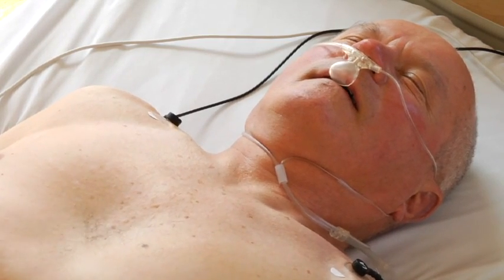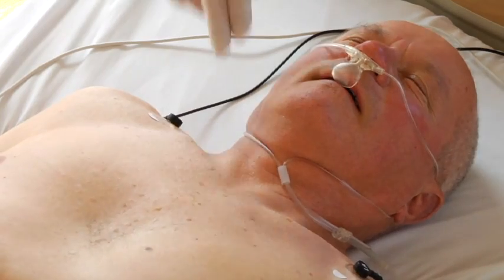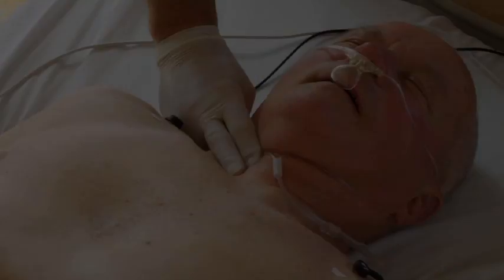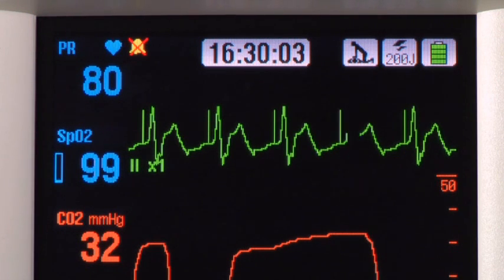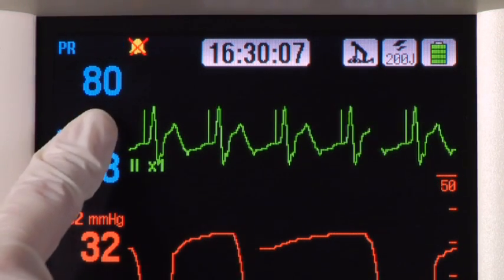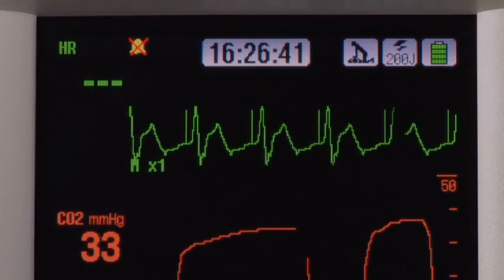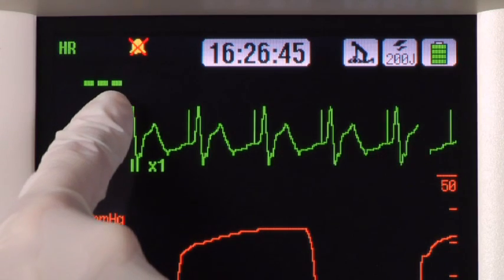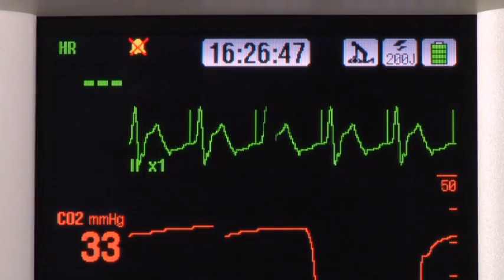Observe the patient continuously while actively pacing, as the patient's response to pacing therapy may change over time. If you are monitoring pulse oximetry while pacing, you will see the patient's pulse rate displayed instead of a heart rate. If you are not monitoring SpO2, you will see a dashed line instead of a heart rate, and the heart rate alarms are disabled.